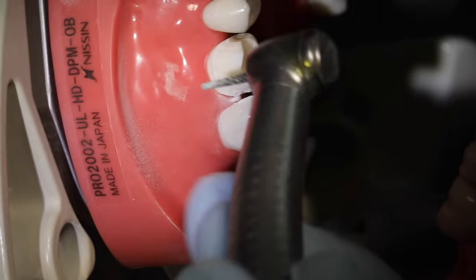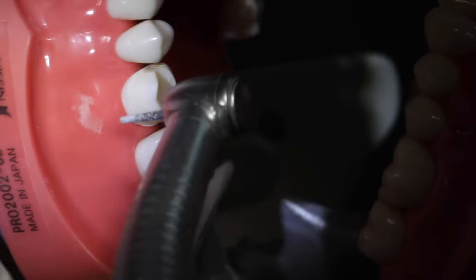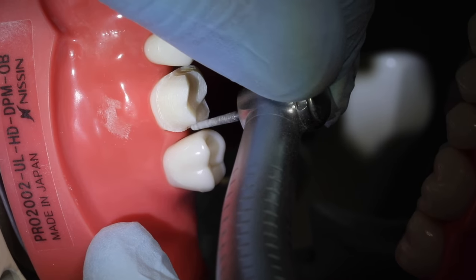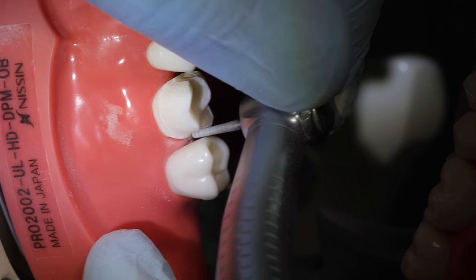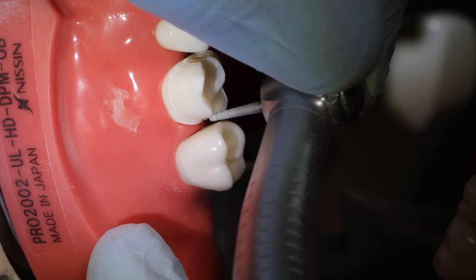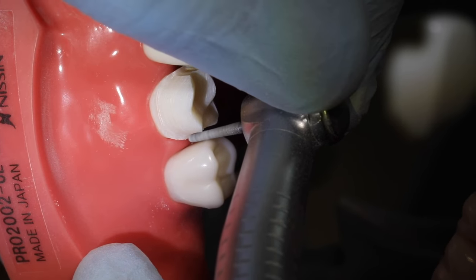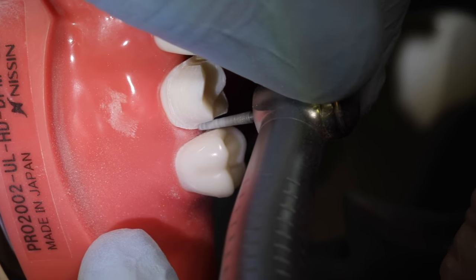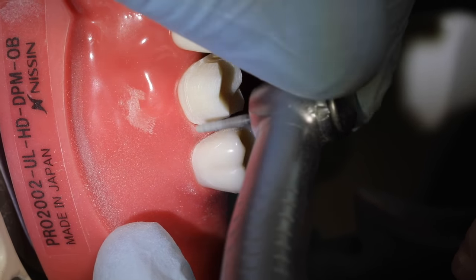Keep an eye on that adjacent tooth. If you see a little tooth dust build up, you better go in there frequently and clean it off so you can see it. It's very easy to have the tooth that you're preparing push you into the adjacent tooth if you're not careful. So make sure you hold it very steady. Looks like that shoulder's starting to form nicely.